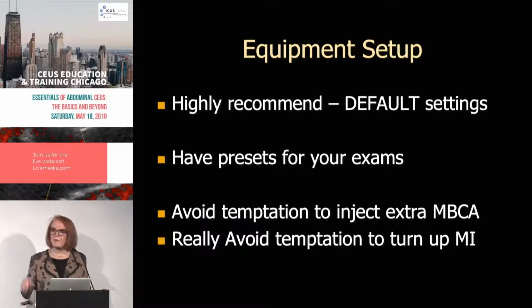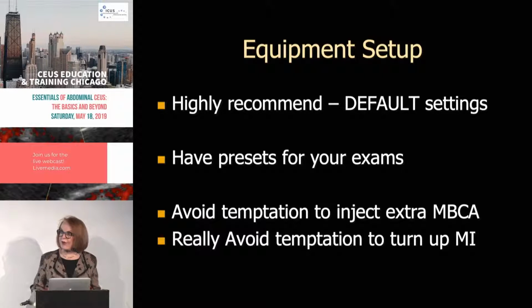So we want to have presets for our exams. And so now I have presets for, like, if I have an abdominal probe, I have a preset that I use if I'm going to do a standard liver, and a different preset if I'm going to look at the bowel. So we have things optimized. We do this with our application specialists. And so these are all very valuable things.